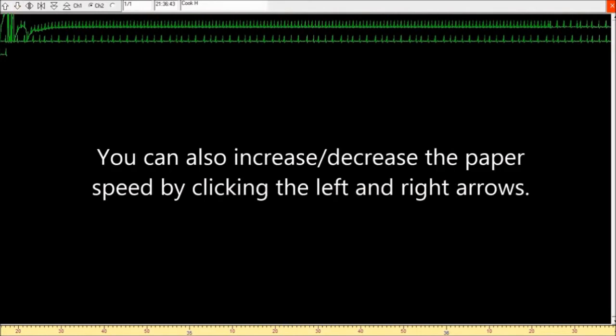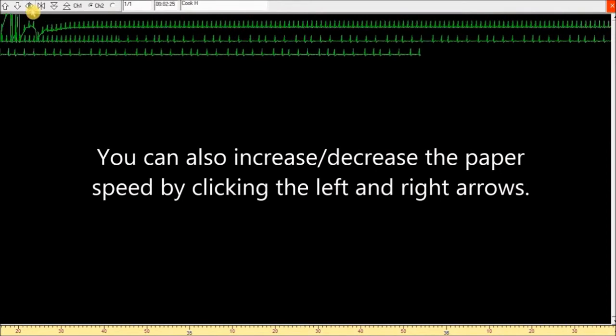You can also increase or decrease the paper speed by clicking the left and right arrows.